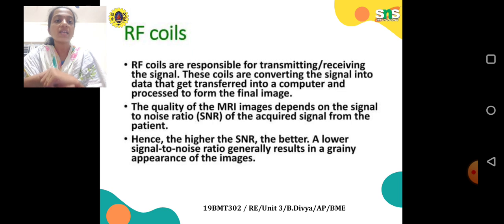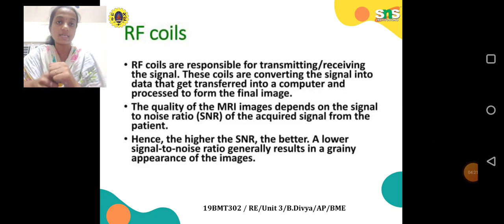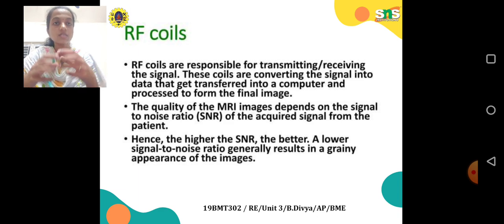Next are RF coils. What is the use of RF coils? RF coils are responsible for transmitting and receiving the signals.